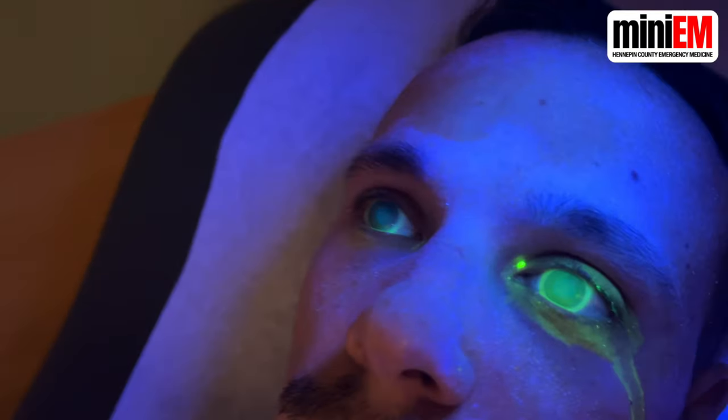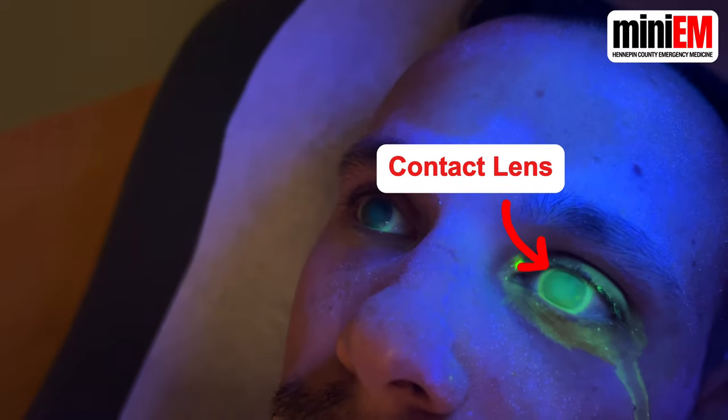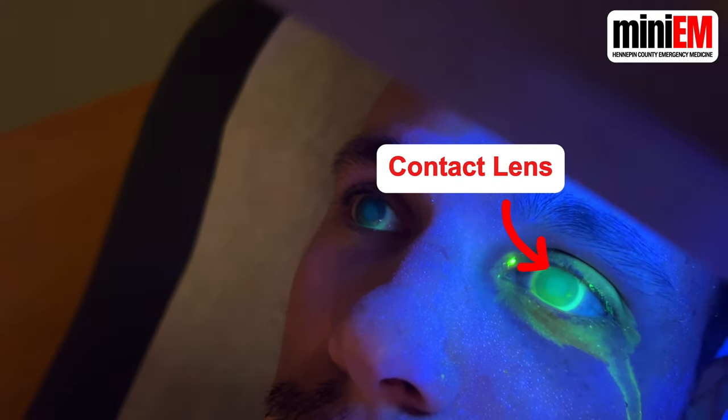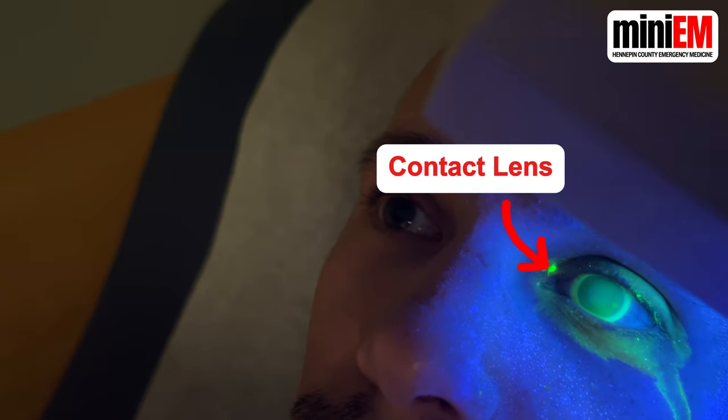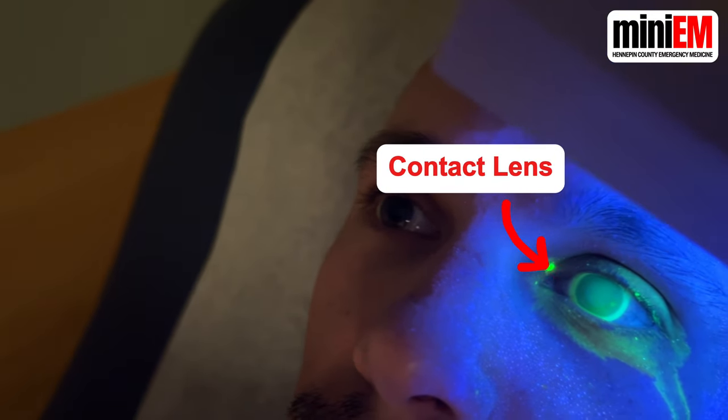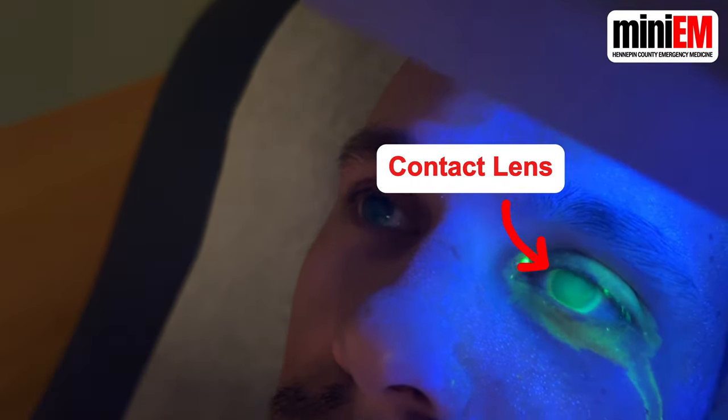Welcome to Mini-EM. Here's how to do a fluorescein exam in the emergency department. If your patient wears contacts, make sure they take them out. They shouldn't put them back in for a few hours because the fluorescein will permanently stain them.